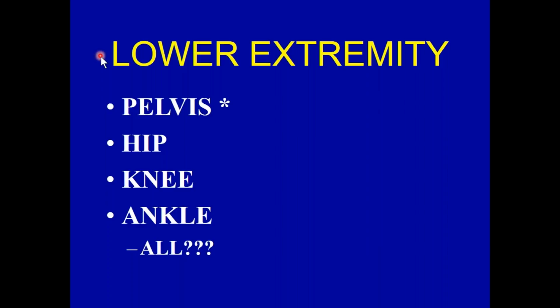So what I've done when I was taking x-rays, or the teaching point I'd like to leave you with, is all of these x-rays, if you're taking a pelvis exam, a hip, a knee, or an ankle, I want you to turn the patient pigeon-toed or inward rotation. Why is that? It will put the pelvis and the hip into a more correct anatomic position.